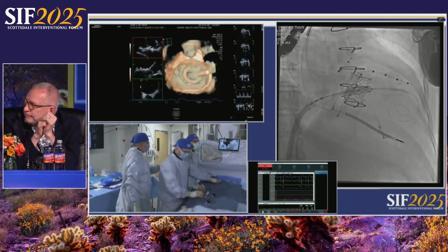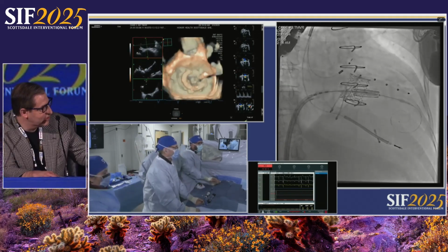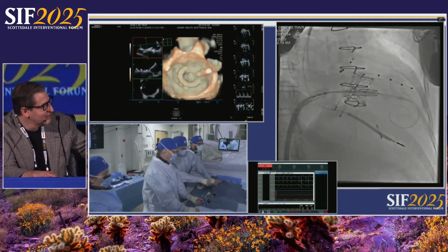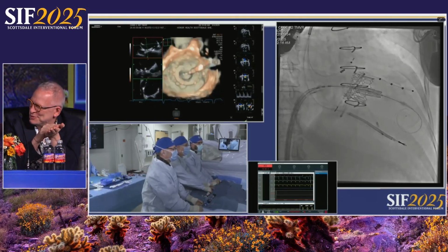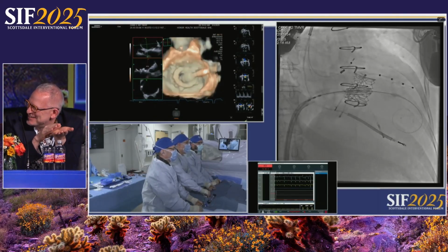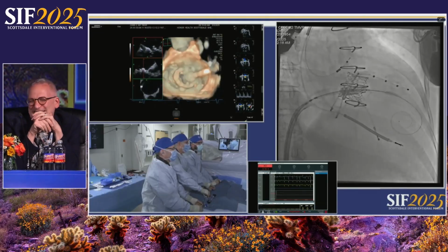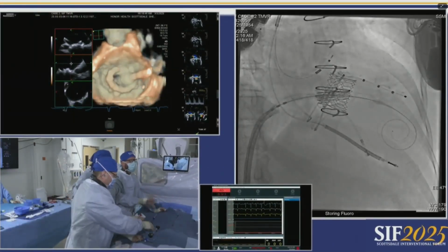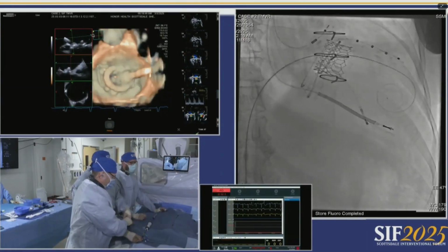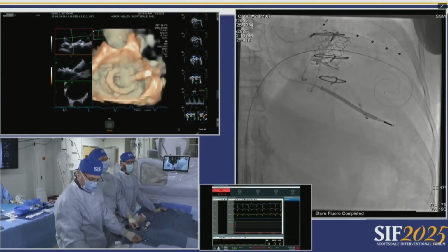And so there's nothing you can do with electrosurgery? I thought you'd say you would take some catheter and cut it out and split it in half. Well, if you didn't prepare for that with the first one, there's nothing to do now, right? So it's going to be oblique. That's okay. That's fine. I think one of the key things is they decided to go with the smaller valve. And, you know, I'd much rather overexpand a smaller valve than underexpand a 26.